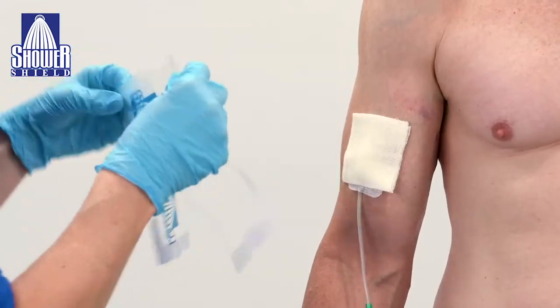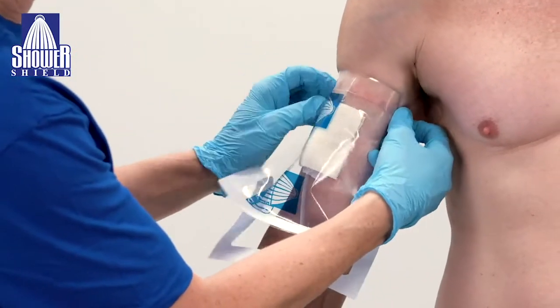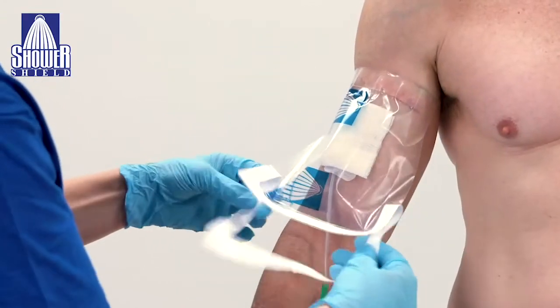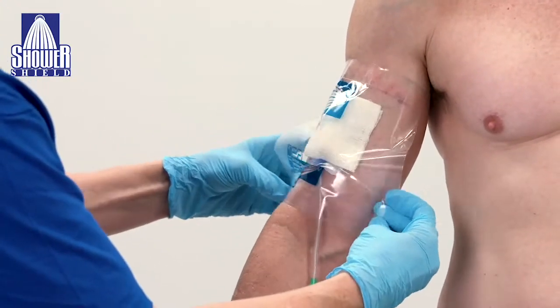Remove the paper backing from the top edge of the dressing and apply the top edge just above the dressing before sealing the bottom edge. Next, apply the bottom edge just below the bottom of the dressing.